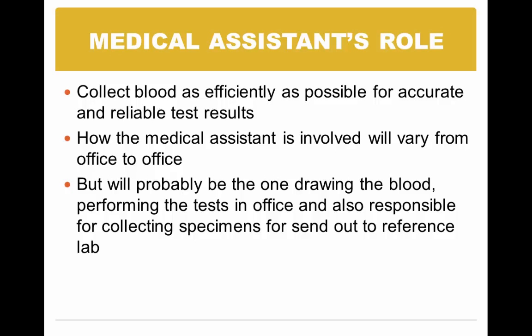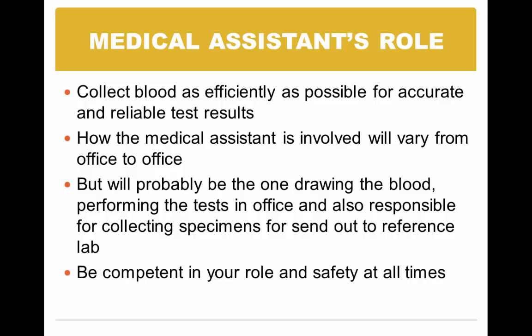You as the medical assistant have a goal for accurate results. So that starts when you obtain the blood sample to perform the test, and then to be able to report the test results. If you have any breaks in these areas, it can change the reliability and accuracy of your tests. So you want to make sure that you're drawing blood in the appropriate tubes.